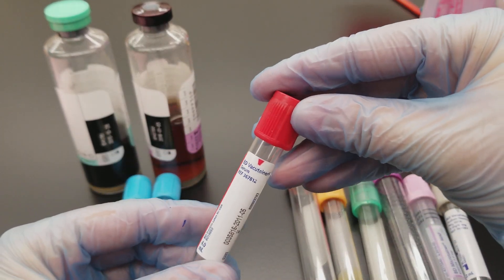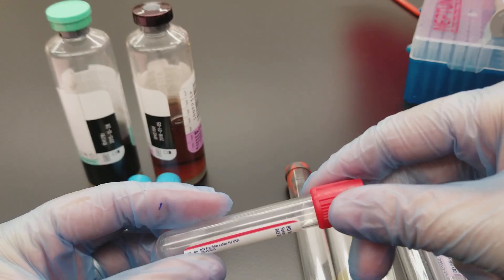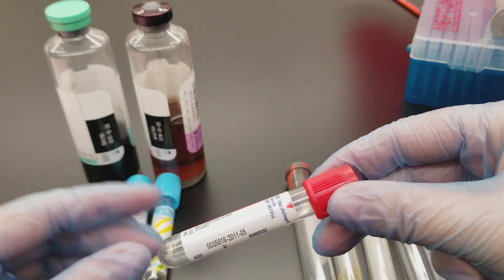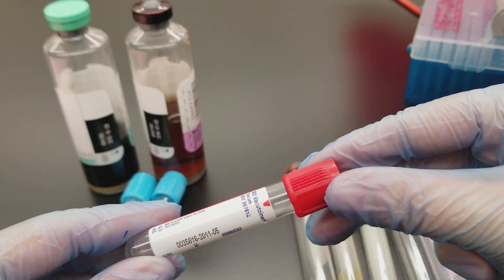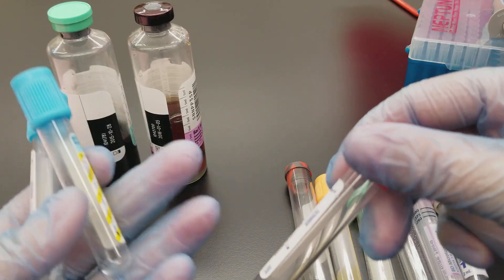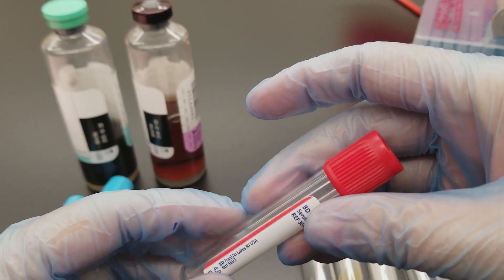This is a serum tube — it is a non-additive tube, or it could have a clot activator, and it's used for routine chemistries. The clot activator has silica in it and enhances coagulation, so we go from wanting to stop coagulation to wanting it to happen. What we want is serum, which is the liquid portion of the blood after the blood has clotted. We would spin this down and use the serum for chemistry.